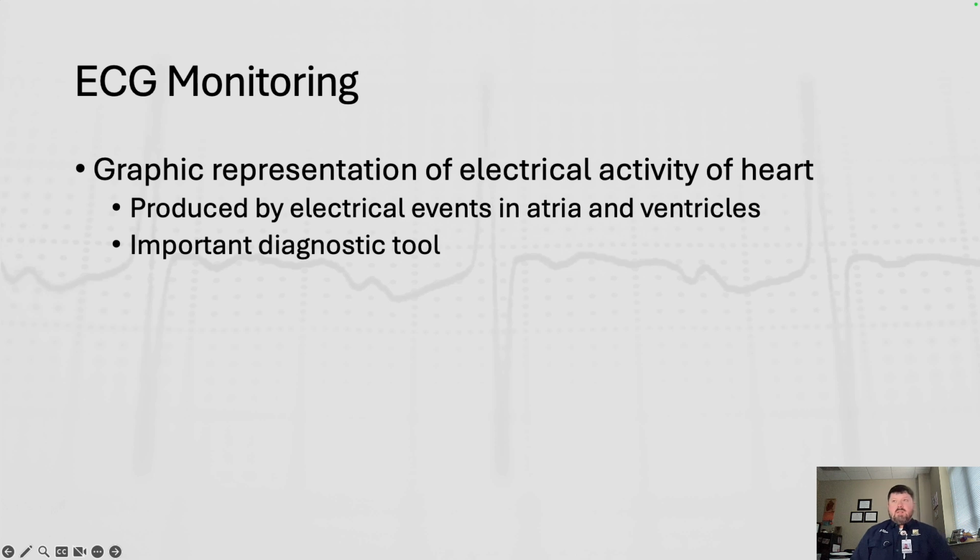So what is ECG monitoring? Well, we know ECG monitoring as those little squiggly lines on the screen on the monitor. We see them in the emergency room, we see them on the ambulance, we see them in the EMS lab, we see them all around where there's healthcare involved. But essentially what we're looking at is the sum of all the electrical activity in the heart being shown in one particular view on the monitor.